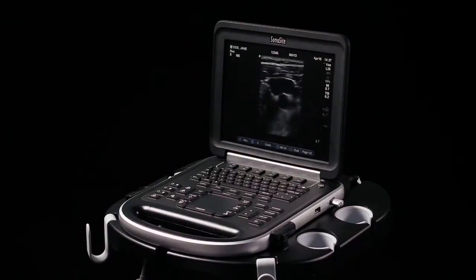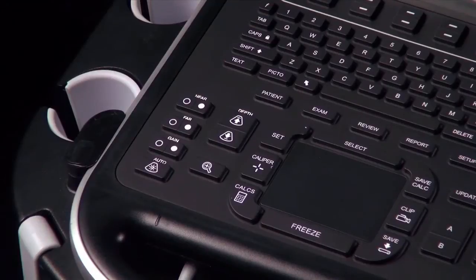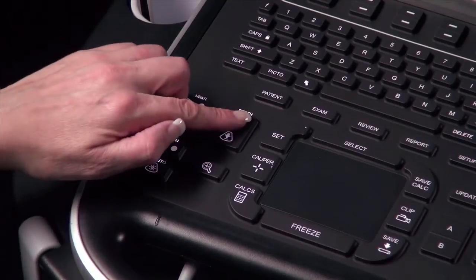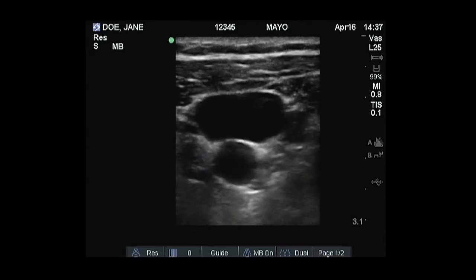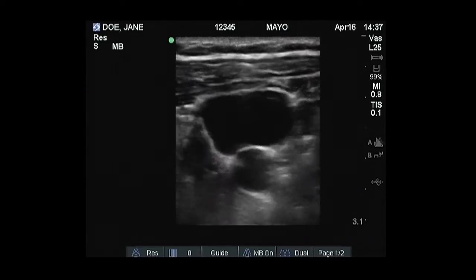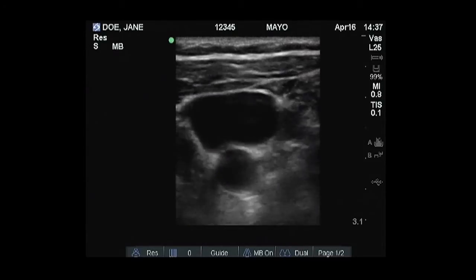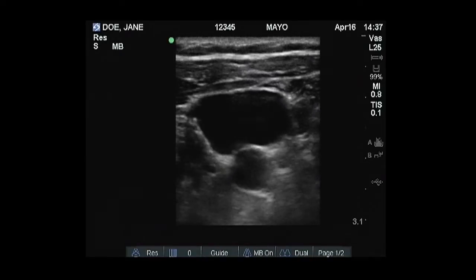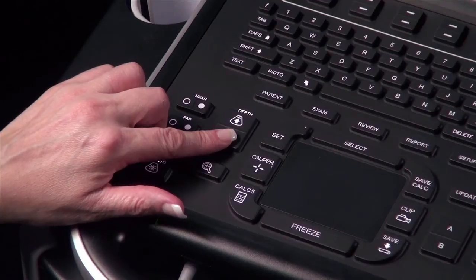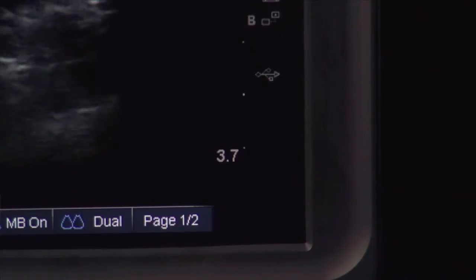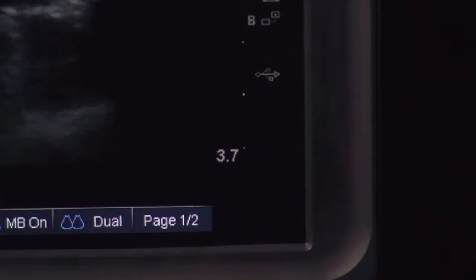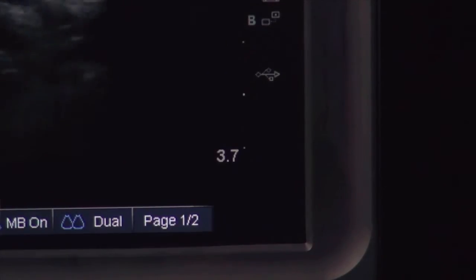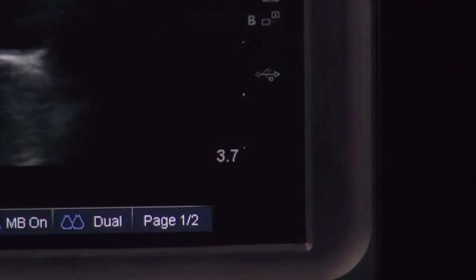Once you have located the area of interest, adjust the depth of image to center the area of interest in the middle of the image display. As you adjust the depth, the maximum depth number changes in the lower right corner of the screen.